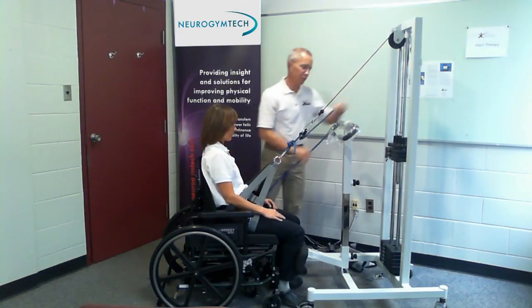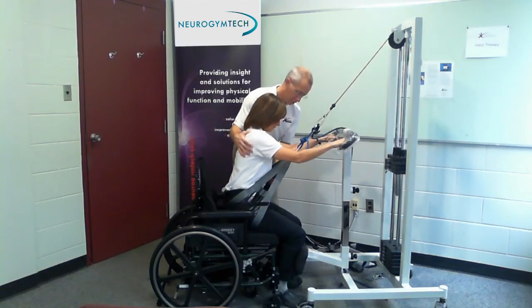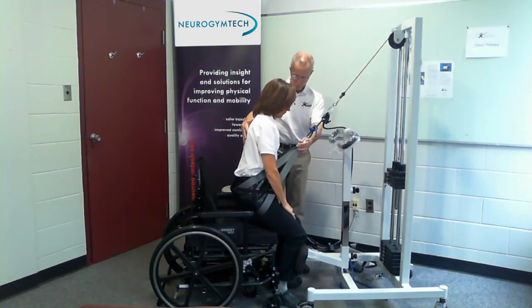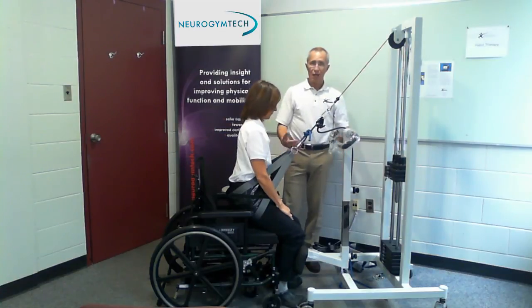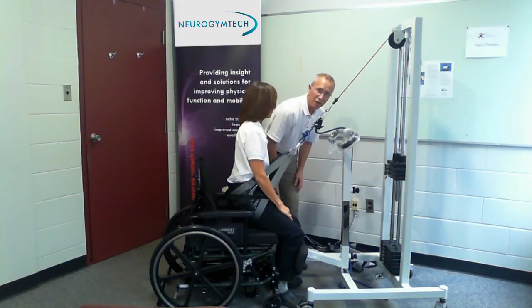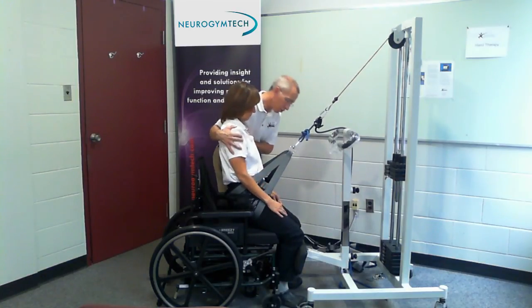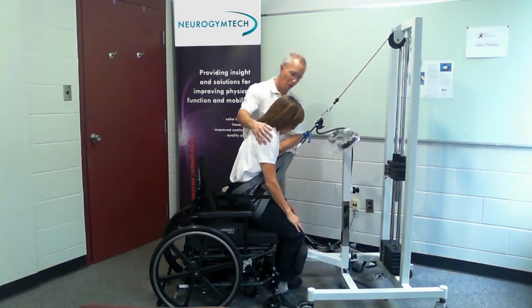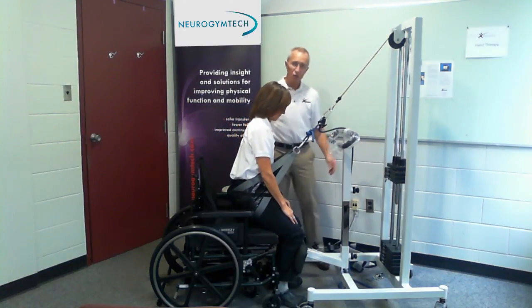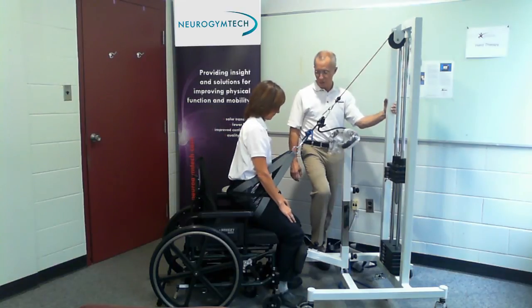This patient is a plopper — high level patient. Put your hands here and come on up. Put your hands in your lap just like this, and now put your bottom about three inches above the chair and hold. You can count to 20, get her to go down another inch, and count to 10 — she can feel her quads firing. If she has a straight back, that's agony. So you can cue her to lean forward, and she feels immediate relief in her quads. Go down a bit more, come up a little bit and hold. You're really working on the landing muscles, and you'll see quite a difference in a person's ability to negotiate those last few degrees with this application.